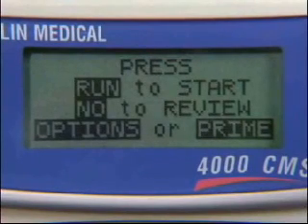Press the Yes Enter button to complete the program. The pump will advance to the Run screen. There are four options on the Run screen: press Run to start, No to review, or the Option or Prime buttons. This is when you would prime the set using the pump.